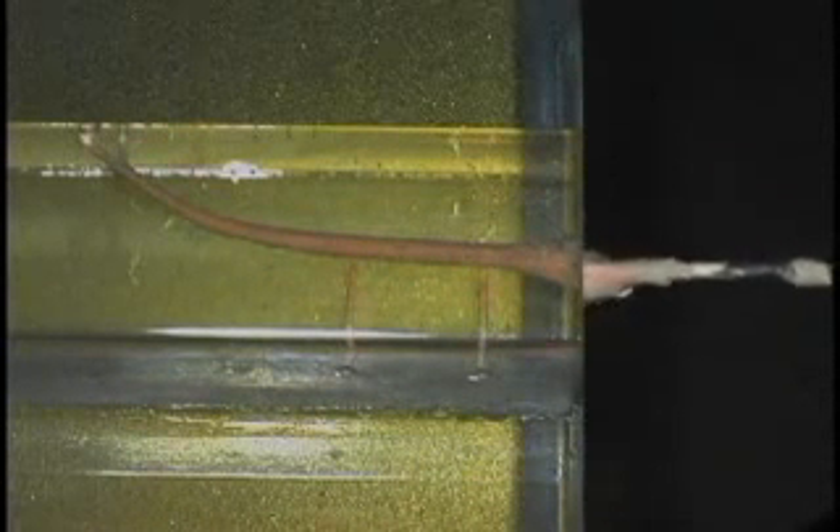Sometimes I use a little circumferential motion. I will gather the surplus gutta percha and the hand plugger comes in to condense the gutta percha until it's solidified at the orifice level. Very simple technique, very rapid.